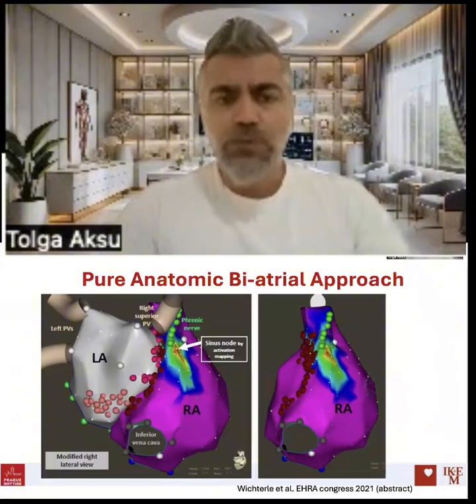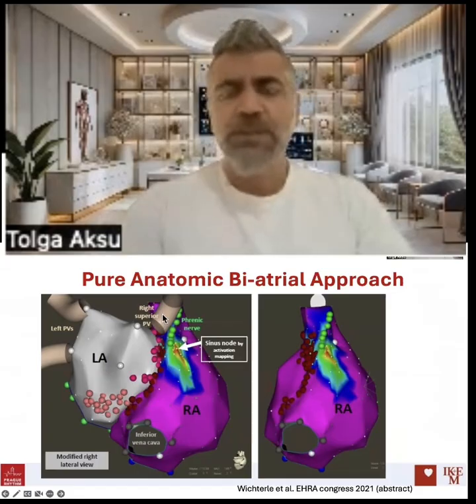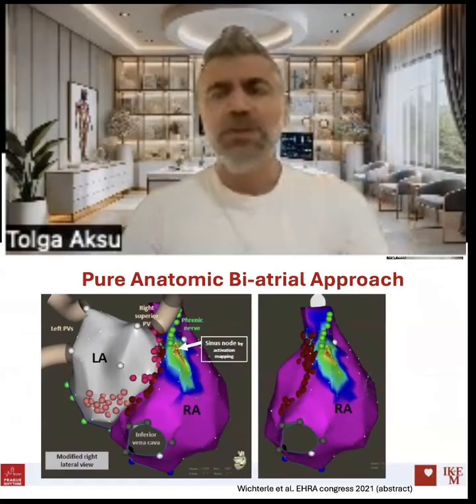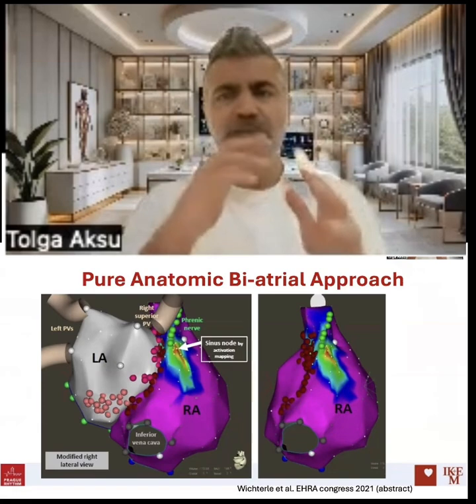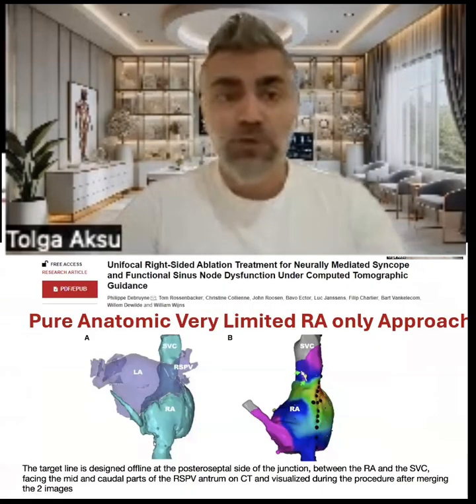This is the approach of Dan Wichterle, my dear friend. They just perform pure anatomic ablation via left and right atrium. It's a very reasonable technique because if you remember my anatomical schematization, great majority of GP is already located in the midline area between left and right atrium. So without using anything and performing ablation in that area, you can eliminate the great majority of autonomic ganglia.